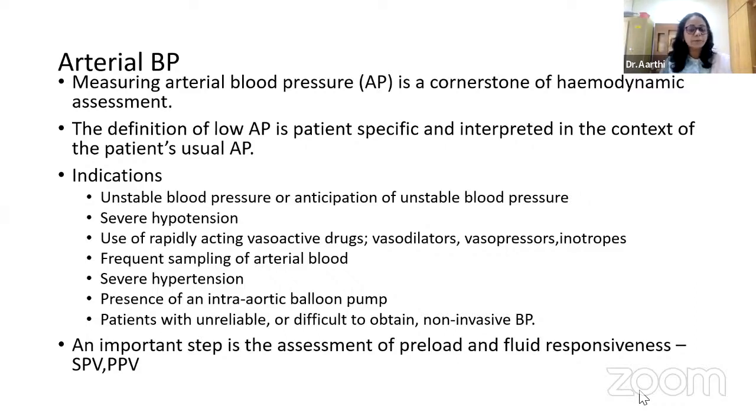Another upcoming indication for arterial blood pressure monitoring is monitoring of systolic pressure variation or pulse pressure variation with respect to the arterial waveform analysis in patients who are mechanically ventilated. And this is an important step in assessment of preload and fluid responsiveness, which I will be talking about shortly.